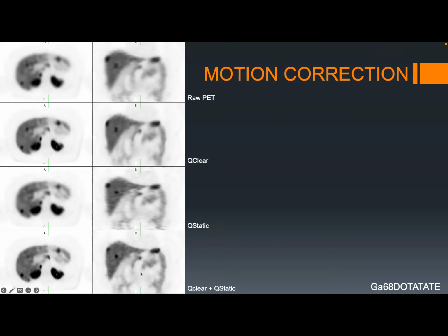So this patient had a distal pancreatic tail neuroendocrine tumor, which was resected and then had metastases, and they wanted to know, is it all only liver disease? So that they should then treat that locally, or did she have distant disease and go for PRRT? That was the point of this exam. And so you can see again, like this pancreatic resection margin, the residual disease becomes much more obvious when you apply all the additional image optimizations and would possibly have just been ignored.